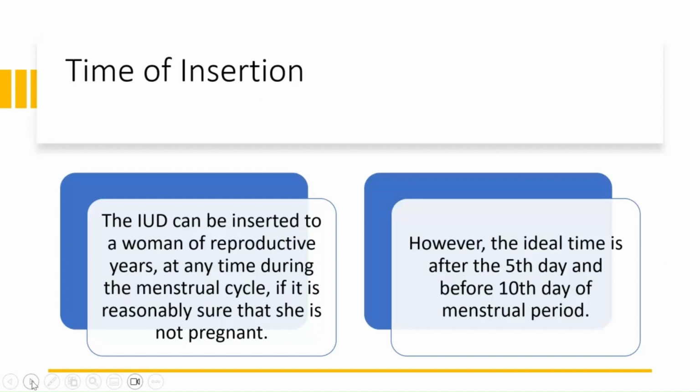Regarding the timing of insertion, it can be inserted any time during the menstrual cycle if the female is reasonably sure that she is not pregnant, but the ideal time is after the 5th day and before the 10th day of her menstrual period.